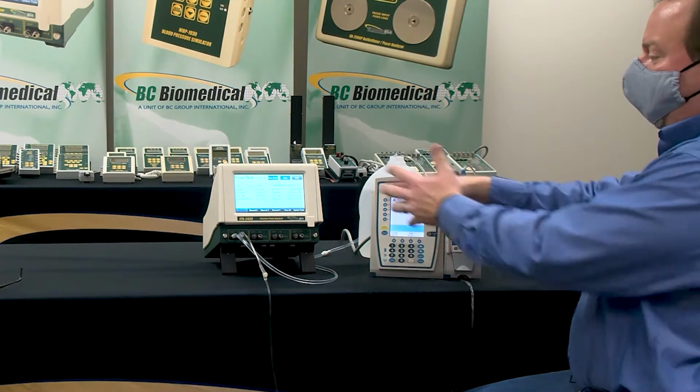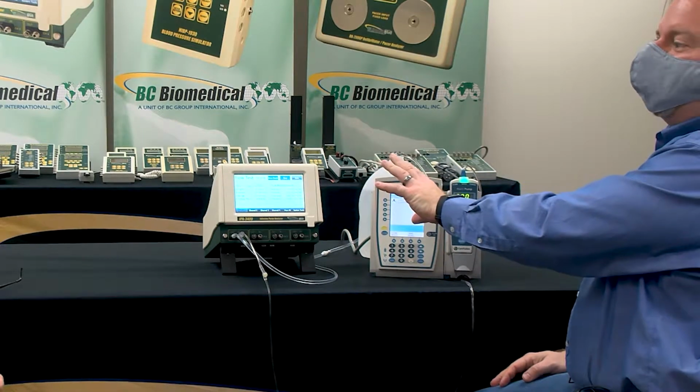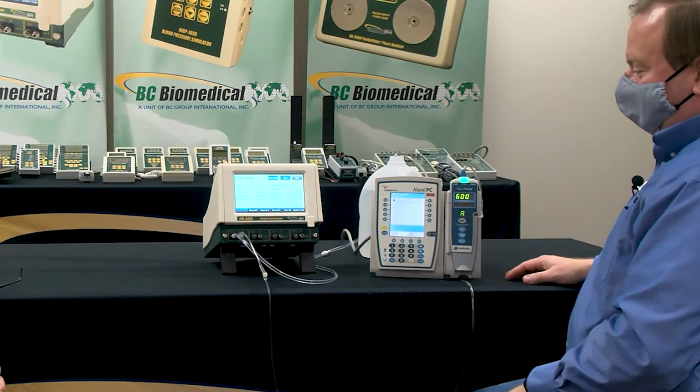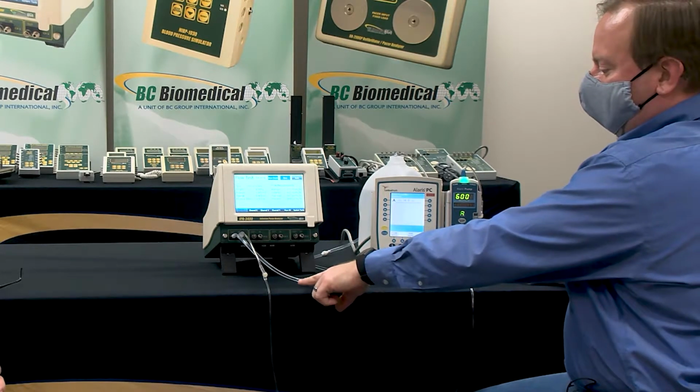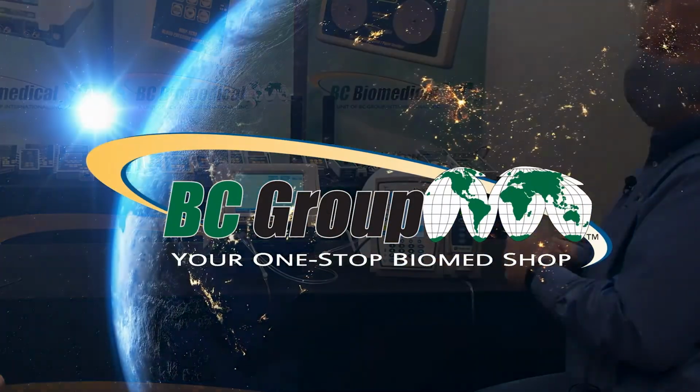So if I got my settings right, it'll do whatever you tell it. It's a multimeter. It's the same thing as your multimeter. If you don't have it set up right, well, you're gonna get the wrong percent error. And so we don't care if there's error in ours, because we're measuring pressure.